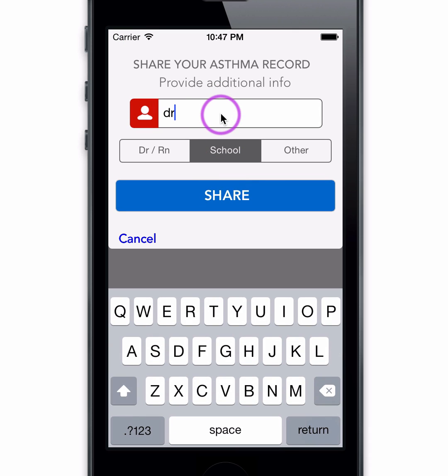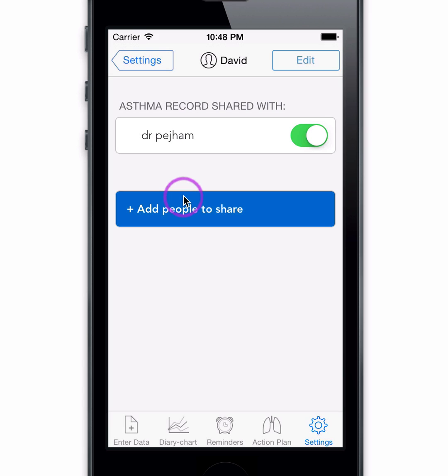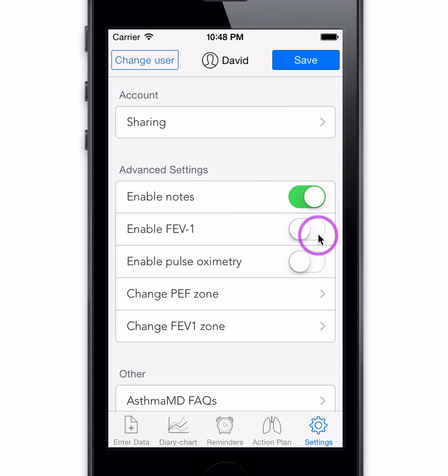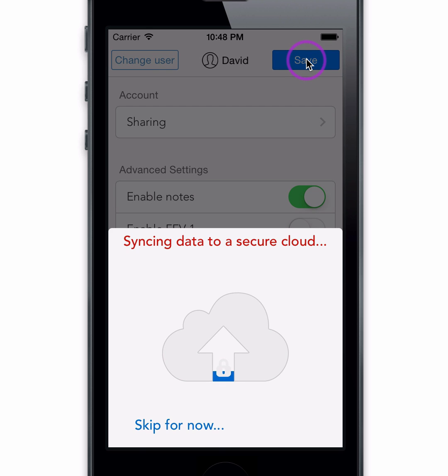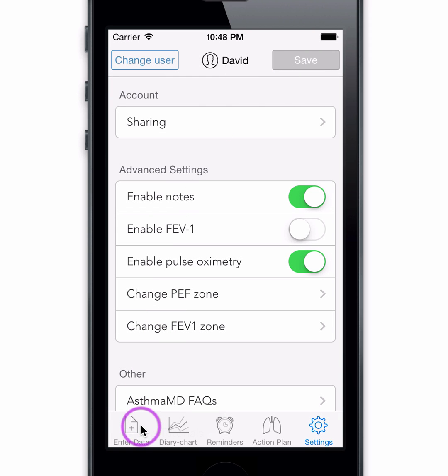You can add a recipient's email address, name, and title, and start sharing. You can also add additional functions such as FEV1, pulse oximetry, and notes. Be sure to save your changes before you leave this page.